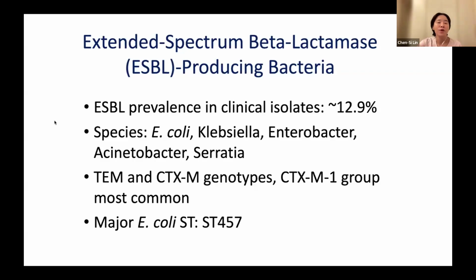Next I will share some data we've obtained from our animal hospital in our university. This study is already published, and we collected many samples from animal cases. We tried to investigate the dominant bacterial infections as well as the potential antibiotic resistance phenomena. In Taiwan, the studies conducted in our animal hospital have shown the prevalence of ESBL.